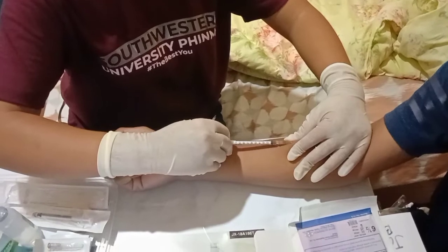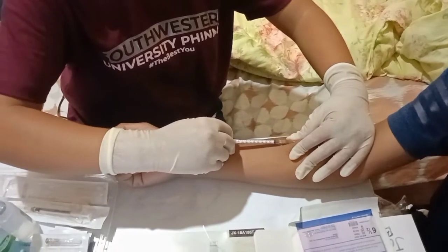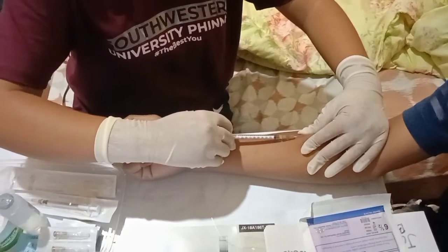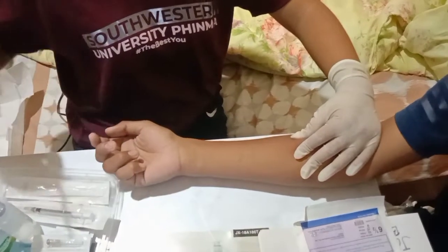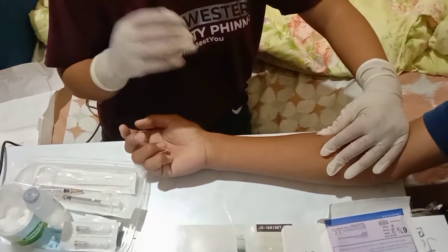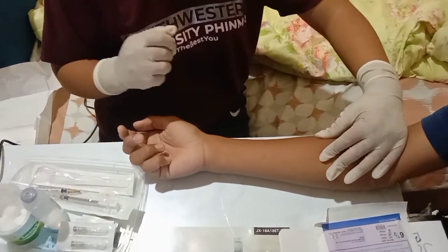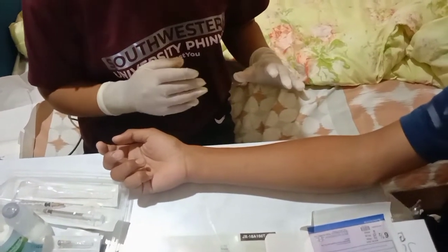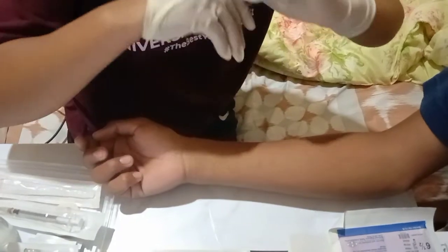Withdraw the needle quickly at the same angle at which it was inserted. Activate the needle safety device and apply a bandage if indicated. Do not massage the area, and dispose of the syringe and needle into the sharps container. Remove and discard the gloves.